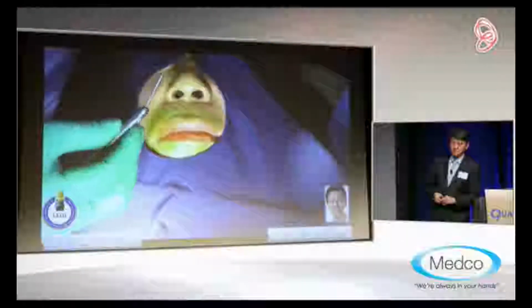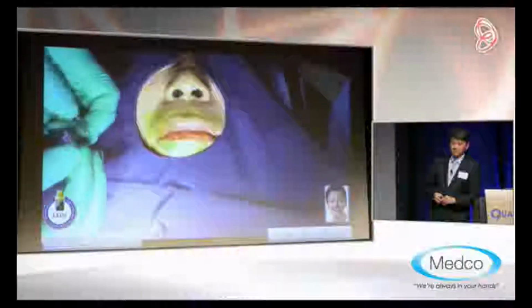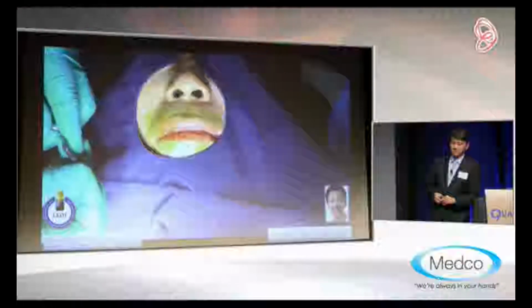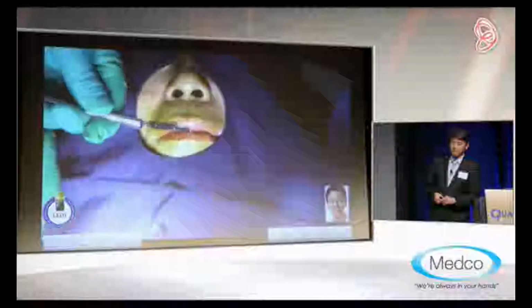Give me the 15 blade. Give me another one too, so that I can show them the double blade. So, this is where you can change the angulation.